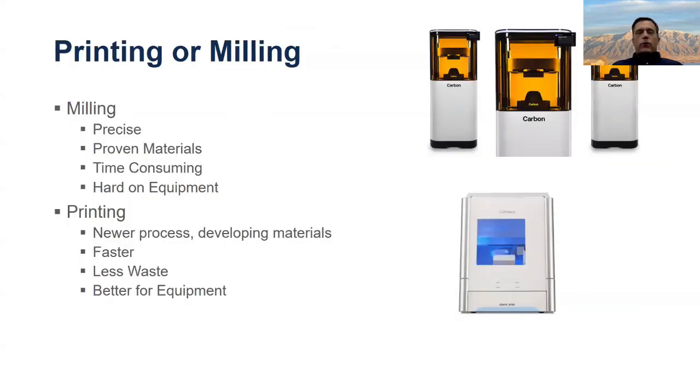So like we talked about, your lab is going to have a preferred manufacturing process. From a theoretical perspective, additive manufacturing is better than subtracting, which means that 3D printing is intrinsically superior. It has less waste, works more quickly. But materials are the bugaboo in that.